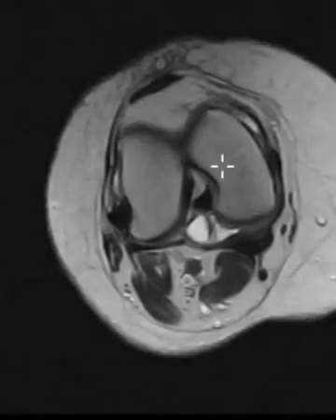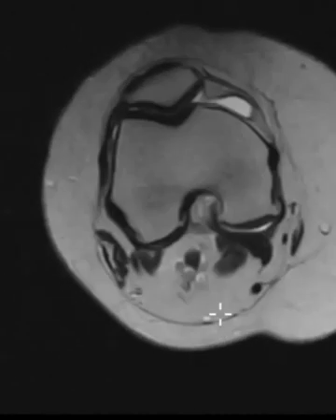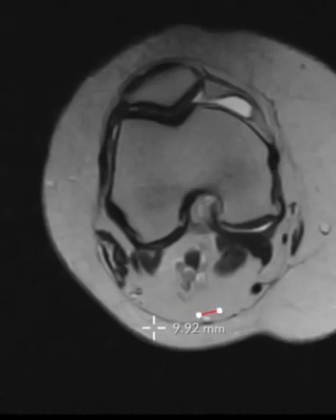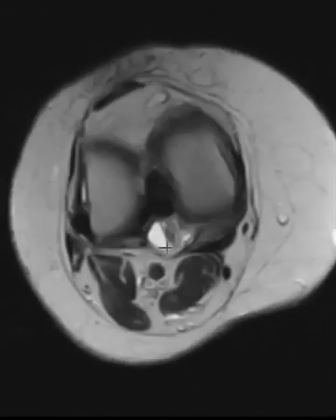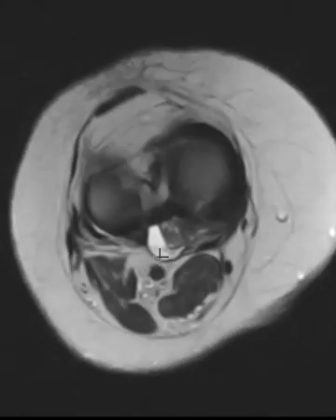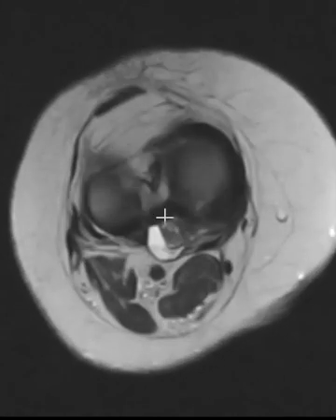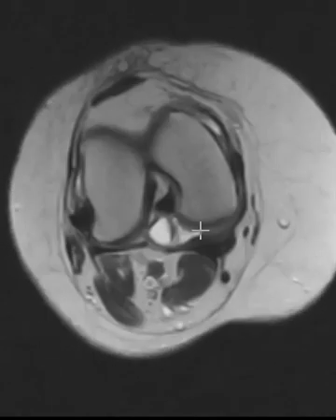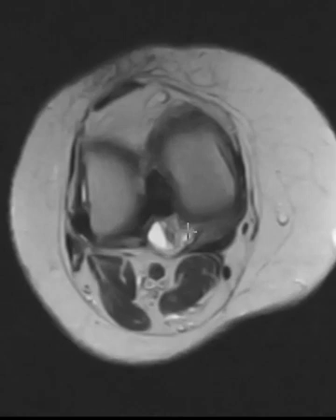Now this is a view where we're looking with the kneecap in the front, the back over here where the table is, the medial side over here, and the lateral side over here. In the very back here is where we see that complex cyst. The really bright area is fluid and the area that's dark is fibrosis, scarring, or solid components. So this is a mixed signal intensity structure, partially cystic with partially solid areas. And again, since it does touch that abnormal meniscus, it may be just a really complex perimeniscal cyst.